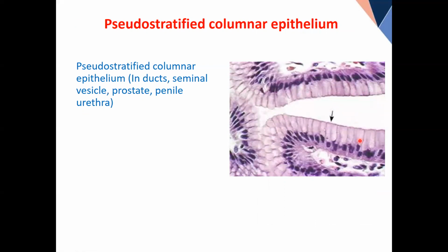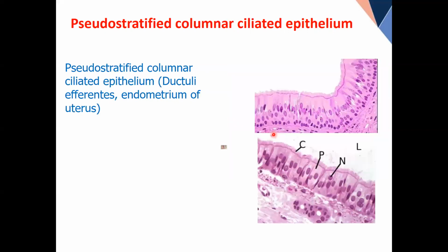Okay? Now, you see, this is the open area. And look at this. This point is important. Then I will keep explaining it. The upper part of the cell in pseudo-stratified epithelium, the upper part of the cytoplasm has no nuclei. All nuclei are trying to be towards the base. They have a tendency to lie towards the base. Nothing is here. This is a very important property. I will name it.